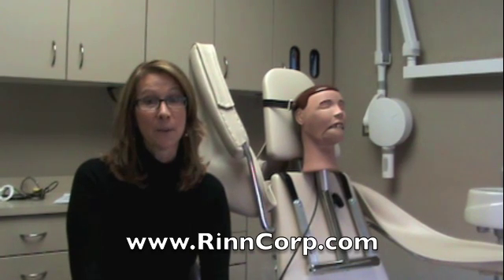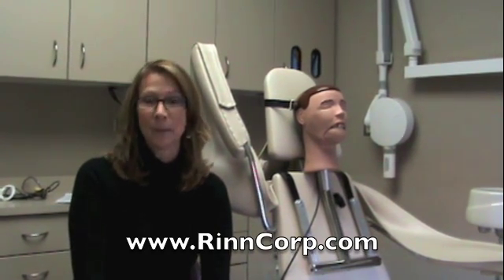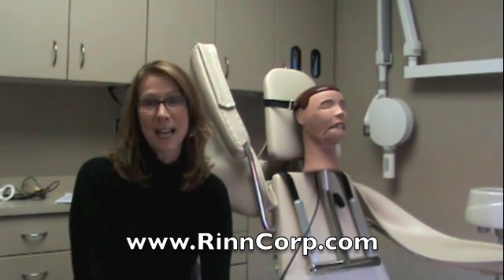Thank you for your purchase from Dentsply RIN. We hope you enjoy your new Dexter for years to come. And don't forget about camp every summer — find out where Dexter will be going this year at www.rincorp.com.